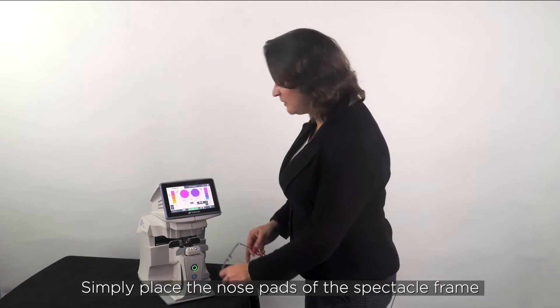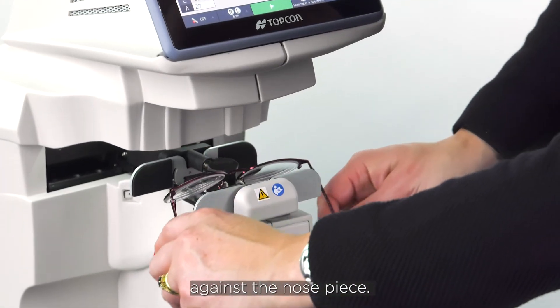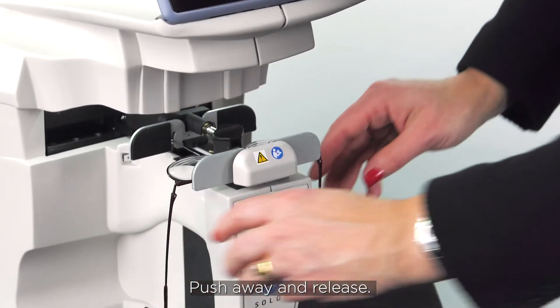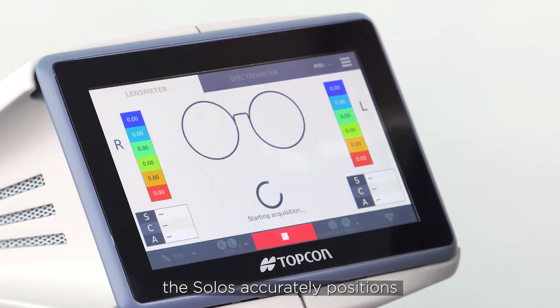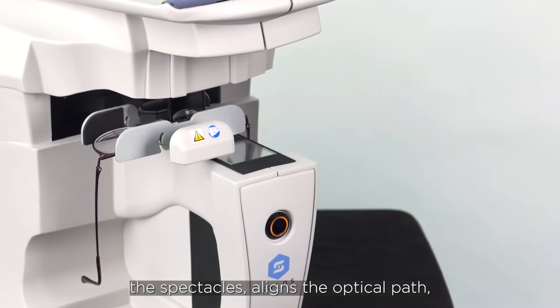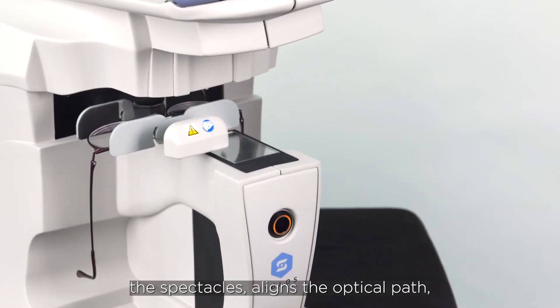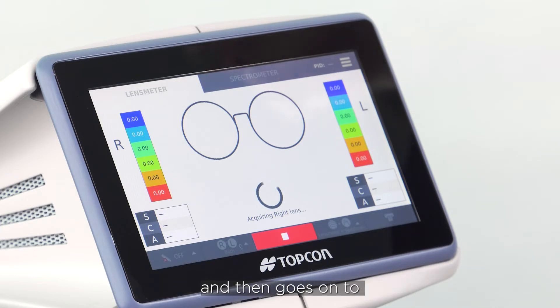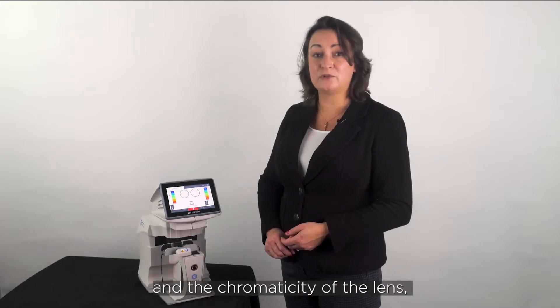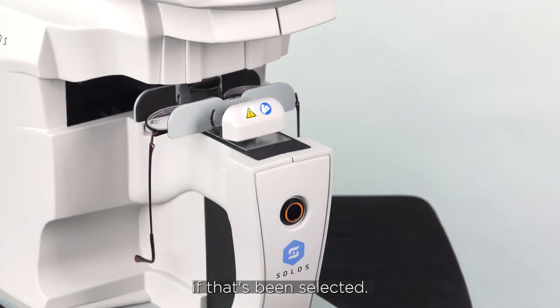Simply place the nose pads of the spectacle frame against the nose piece, push away and release, and then with just the touch of one button the Solos accurately positions the spectacles, aligns the optical path, maps all aspects of the lens power, and then goes on to measure the transmittance and the chromaticity of the lens if that's been selected.